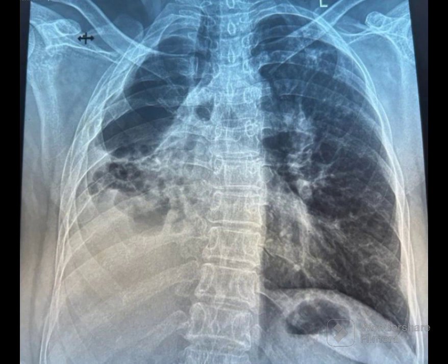Note here the trachea and the heart shadow are pulled towards the fibro-cavity. If it had been pneumothorax, it would have been pushed to the opposite side. When in doubt, always do a CT chest before inserting an ICD.